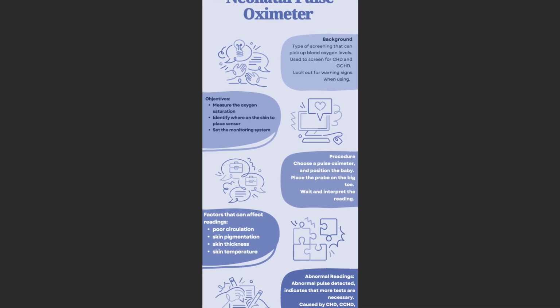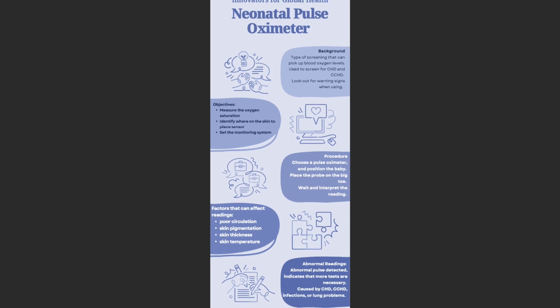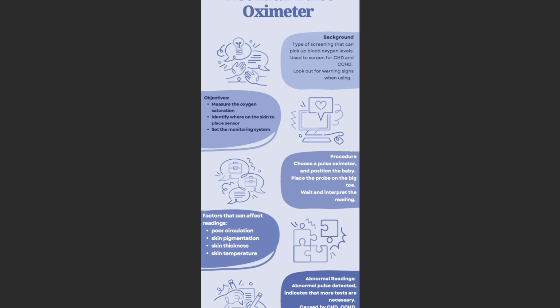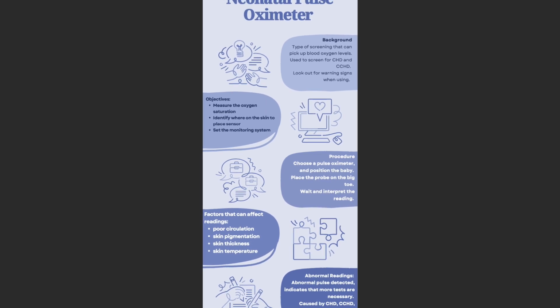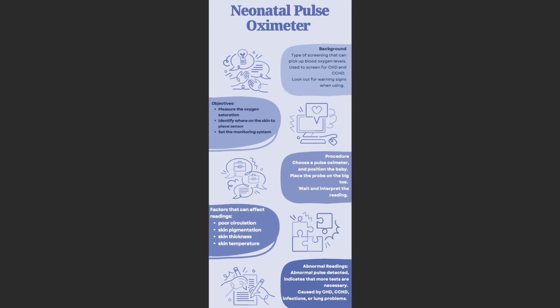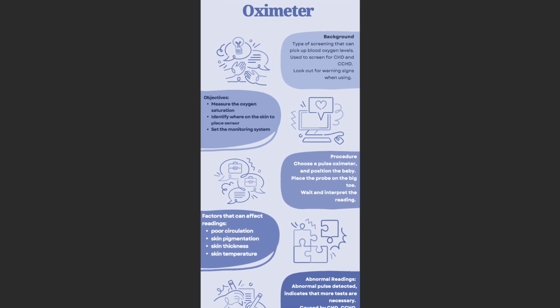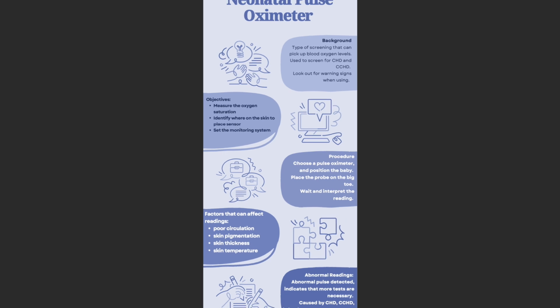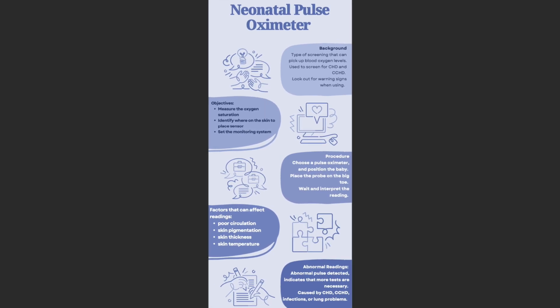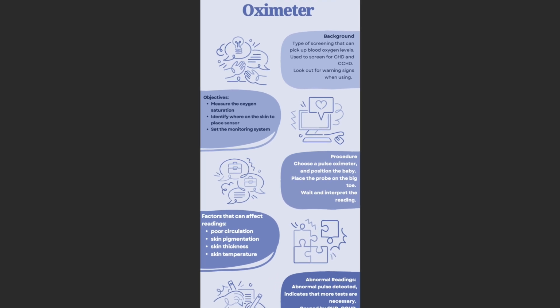Pulse oximetry is a type of screening that can pick up lower than usual blood oxygen levels. This type of screening is done 24 hours after birth to allow the baby's heart to fully adjust to life outside the mother. This method is extremely simple, using sensors placed on the skin. By monitoring this, you can prevent illness in the baby even before they become sick.